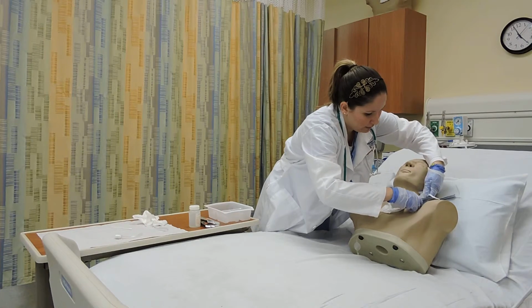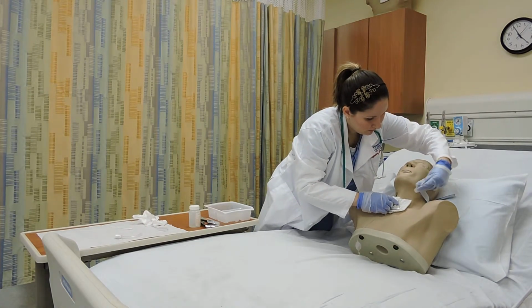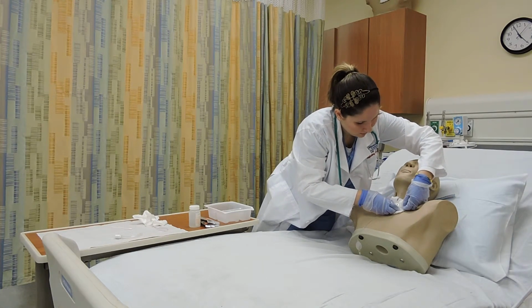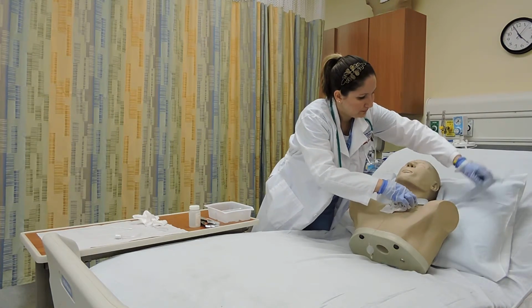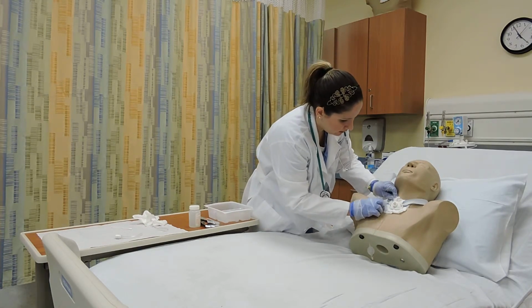We're going to remove the other side. And secure it. And we can readjust the gauze if we need to.